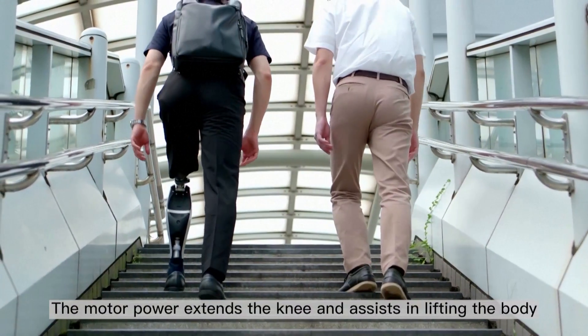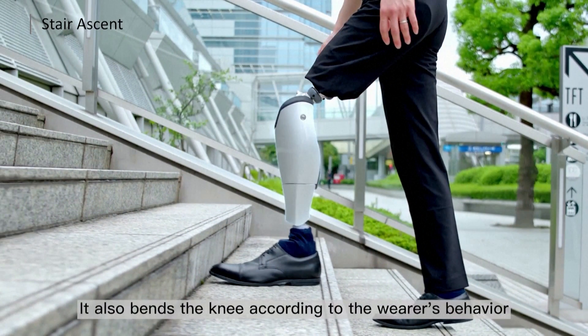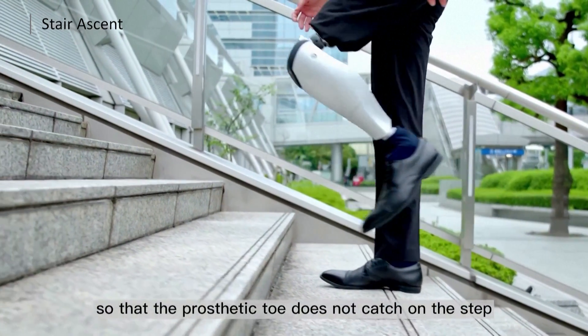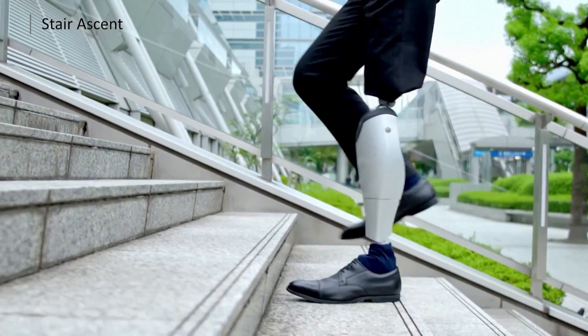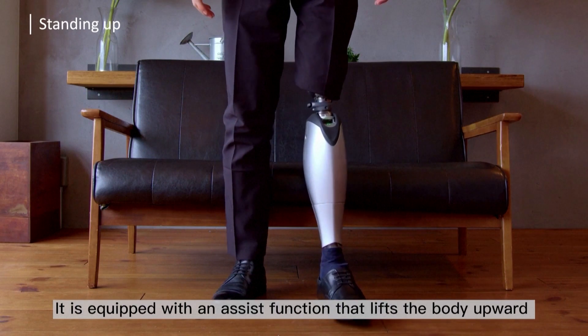Motor power extends the knee and assists in lifting the body. It also bends the knee according to the wearer's behavior so that the prosthetic toe does not catch on the step. There are several sensors, a motor, and a battery inside. The sensor can detect user intent and movement in real time, and then the motor is controlled to give power to assist the user's movement in each environment. It is equipped with an assist function that lifts the body upward.